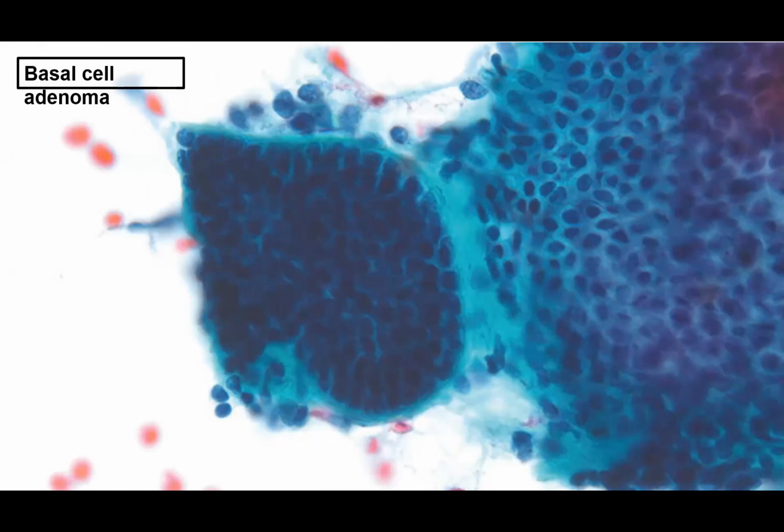This here is a good example of a classic morphology that you can sometimes see with the membranous variant of basal cell adenoma, where you have acellular hyaline membranous material which wraps around the basaloid cells. These tend to be supposedly denser compared to the globules in an adenoid cystic carcinoma. However, this can still mimic other tumours, and as you know, basal cell adenoma can only be definitive on histology, because of whether there is infiltration of the capsule or lymphovascular invasion.